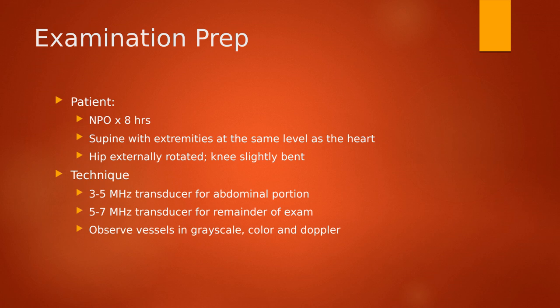We just grouped the bypass information with the upper extremity because we see a lot of bypass grafts for dialysis patients. So that's why it's in that upper extremity category, but it's still the same evaluation and interpretation process with the lower extremity if we were to see a bypass graft down there.